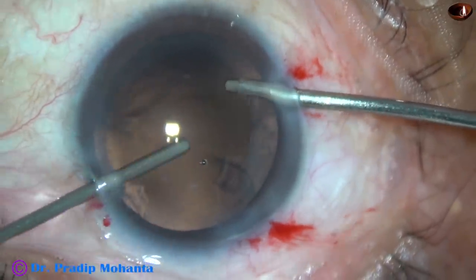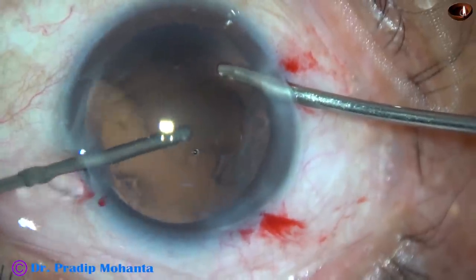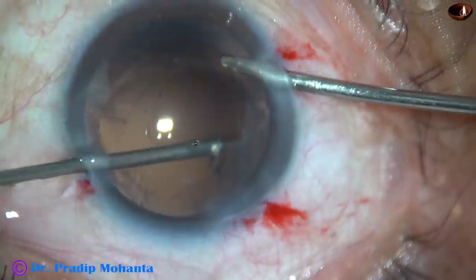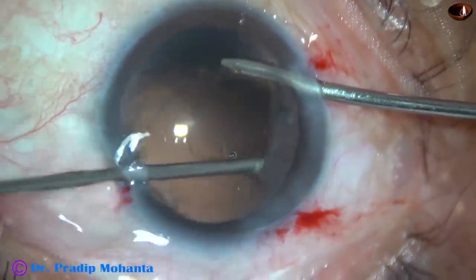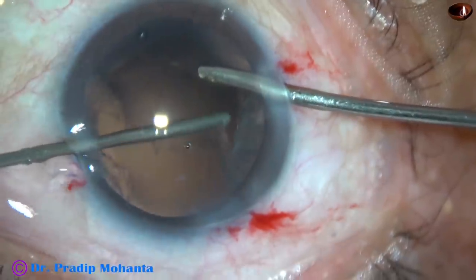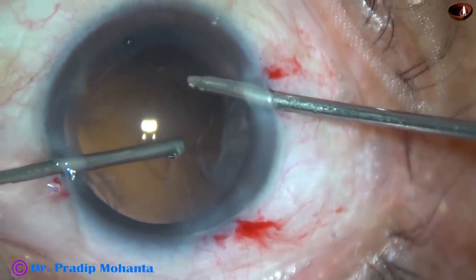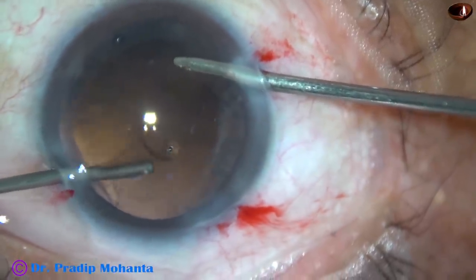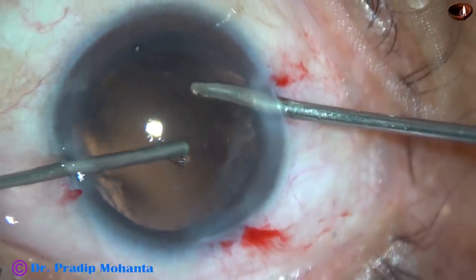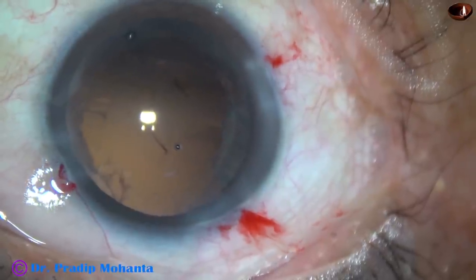And here I tried to aspirate the cortex — it didn't come, so I again went to cutter mode and did cutting by this instrument, a 23G Simcoe cannula. We take care — we must not catch hold of vitreous strands and pull. In this case we must see the vitreous strand; we can easily hold it with Vannas scissors. There, go again through the port and do some more vitrectomy. Try to reach the areas where vitreous prolapse occurred, and do some more vitrectomy.